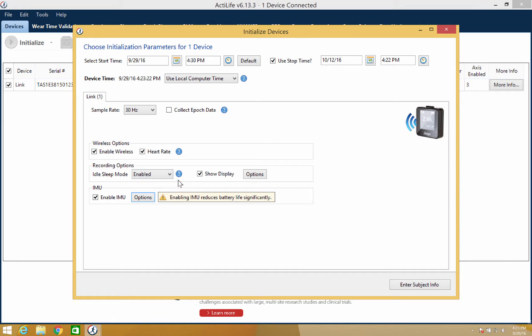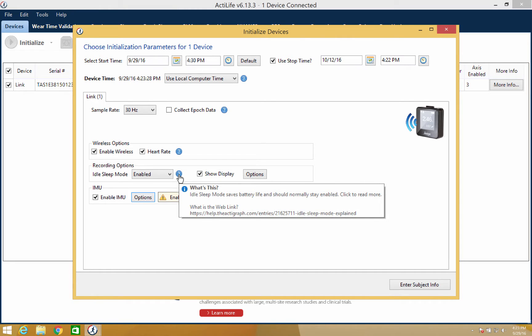Anything that's not covered in this video can be explored by clicking the blue question mark buttons next to each data collection parameter. This will take you to our help page for additional information.